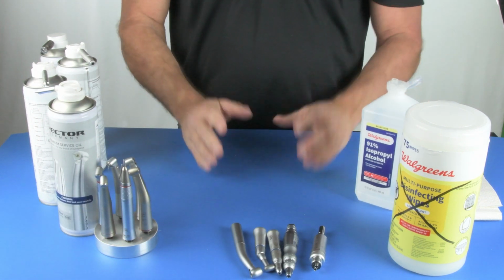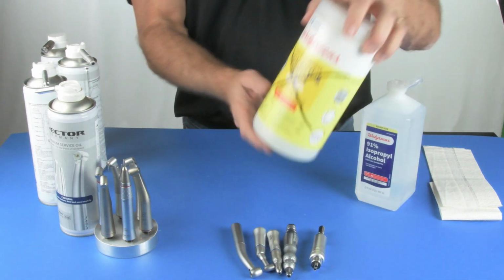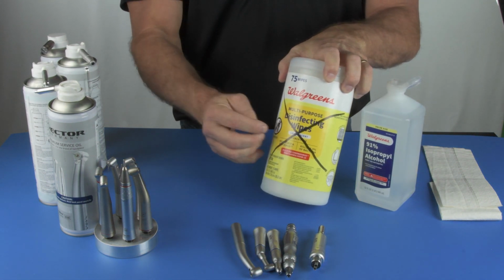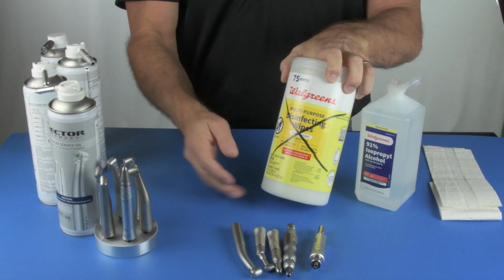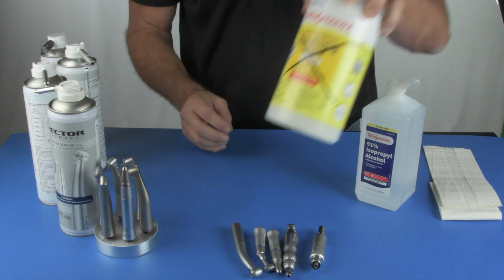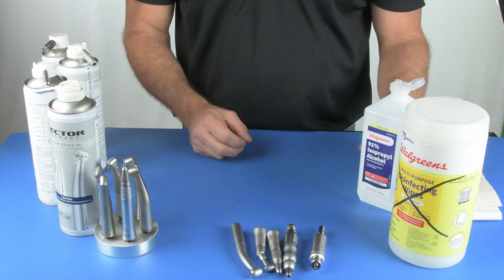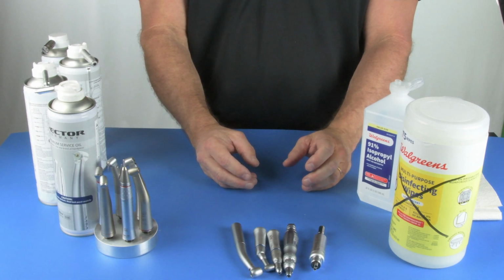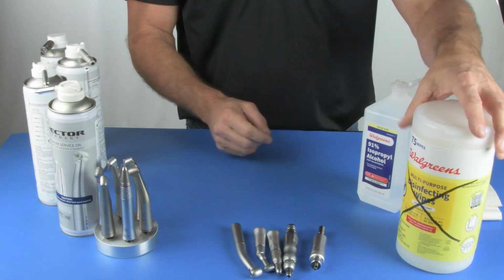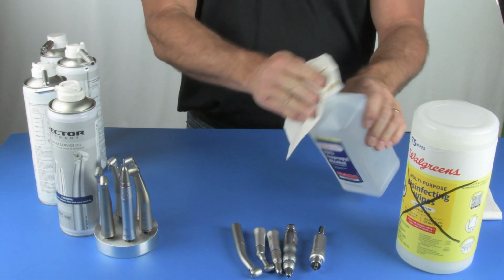Now, one of the things that you absolutely do not want to have on any handpiece surface is any type of disinfectant. There are a few now that are handpiece safe, and they say that, but there are very few. So do not use a cavicide wipe or anything like that on a handpiece. It can be corrosive, especially Cavicide 1 or other products like that that have a tendency to rust the handpieces and eat holes in them. So make sure that you do not use disinfectant wipes and only use alcohol wipes where needed.